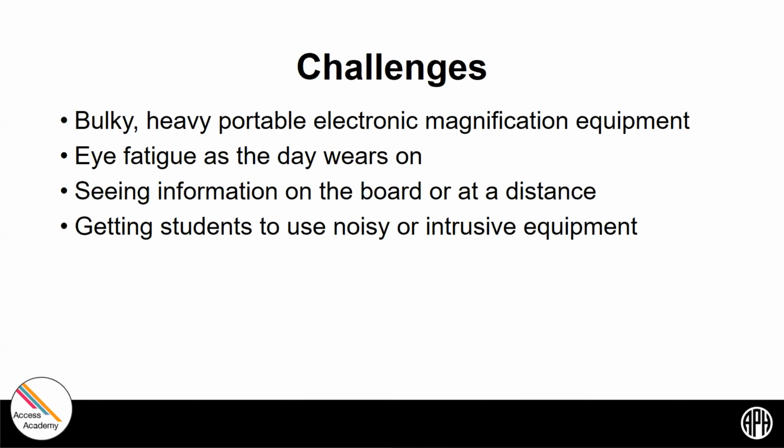There are times that seeing information on a board or from a distance is difficult. And getting students to use noisy or clunky or intrusive equipment can be difficult. We see a lot of these same things with Braille displays, but also with magnifiers. Sometimes folks just don't want to use them or they're too big. So we'll talk about how Juno can help with some of those things.